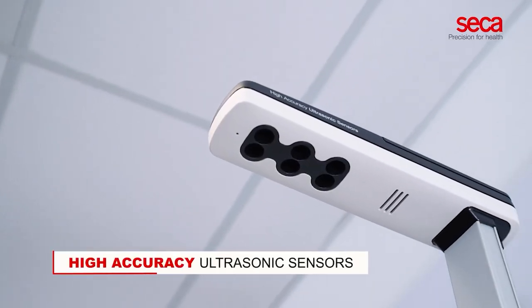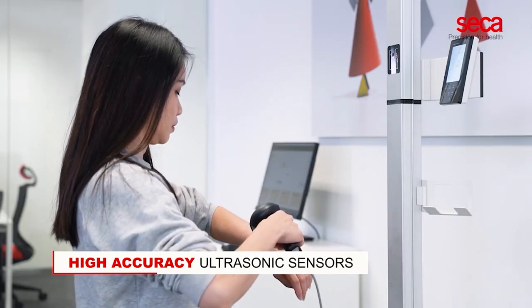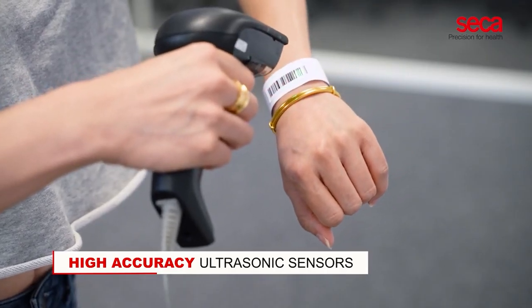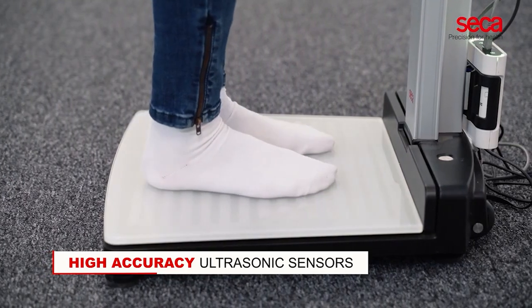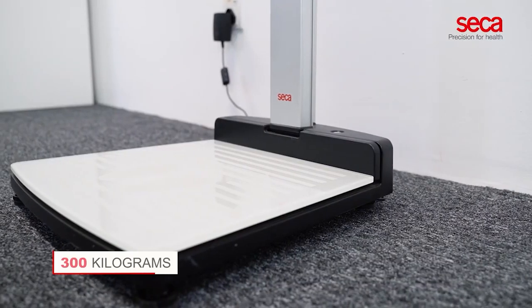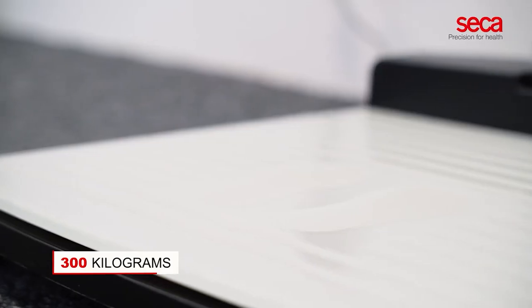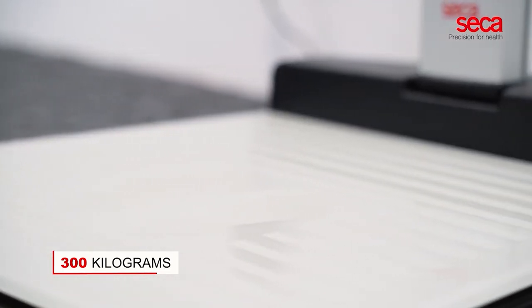With highly accurate ultrasonic sensors, the ultrasonic height measurement is highly precise. This technology eliminates the necessity of direct physical contact between patients and medical personnel. The durable platform, made of non-slip tempered glass, can hold up to 300 kg and is easy to disinfect.